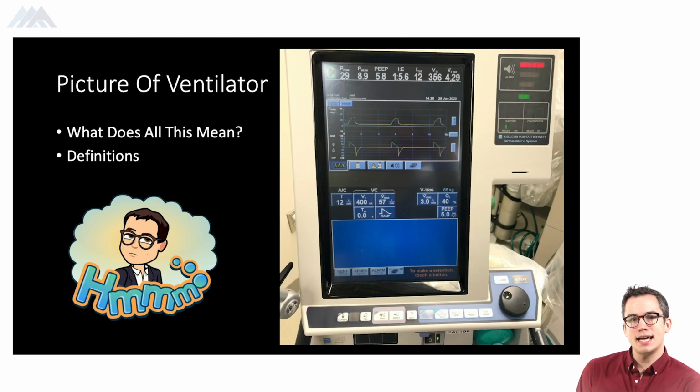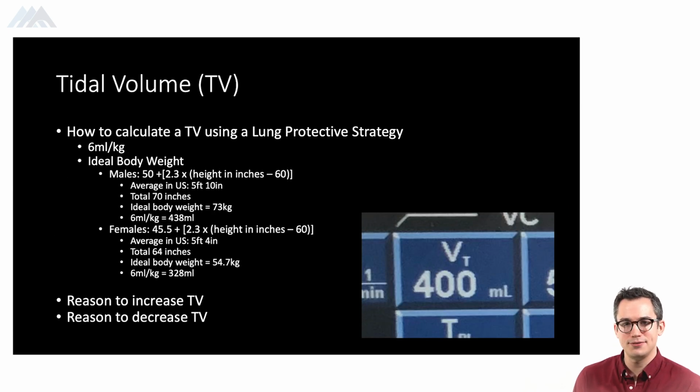If we look at this diagram over here, we're going to see a ventilator, and we look at it and we're so confused. What does all of this mean? What are the proper settings? What is it going to control? Where do I even start? No worries, we'll break it all down definition by definition, and we'll get through it. Let's get started with our first definition, that being tidal volume.